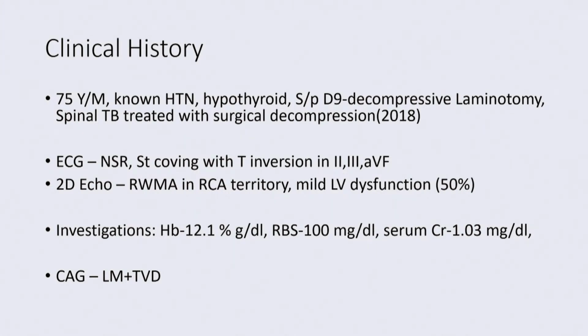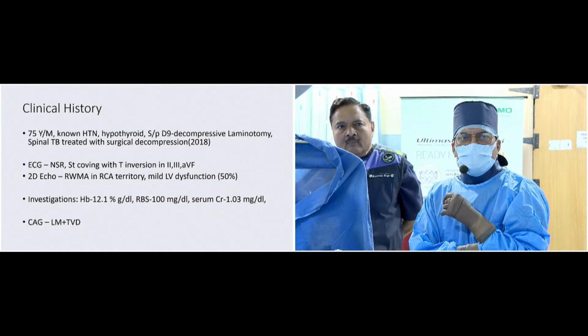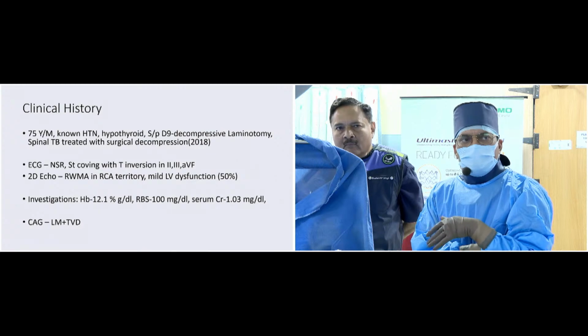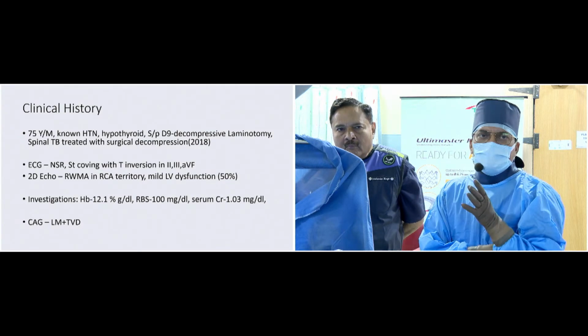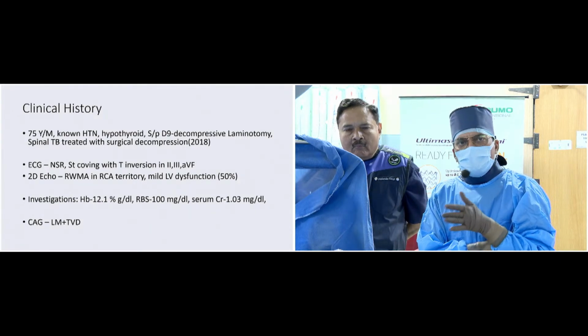There was a diffuse disease of the right coronary, which is dominant. We did a calcium plaque modification using IVUS, and we used orbital atherectomy to do the plaque modification of the mid RCA and distal RCA. Subsequently we implanted stents in the entire right coronary from ostium up to the PDA. Post procedure, the stent is very well expanded.